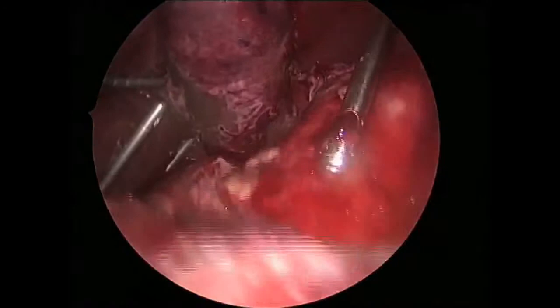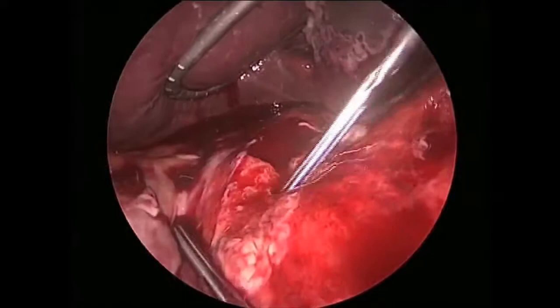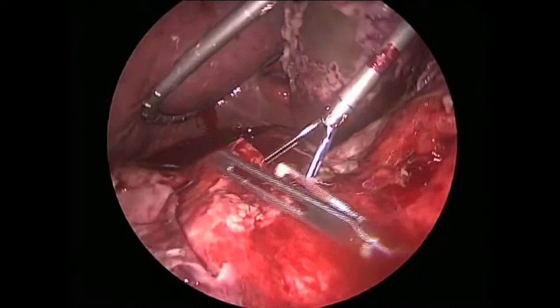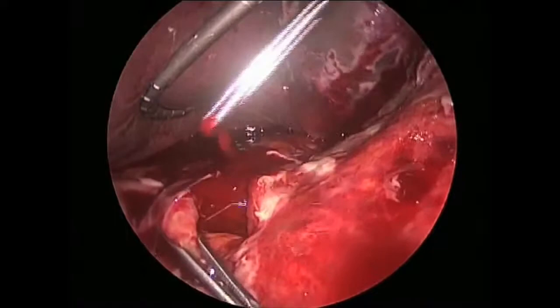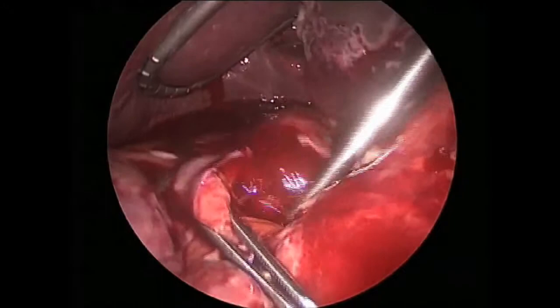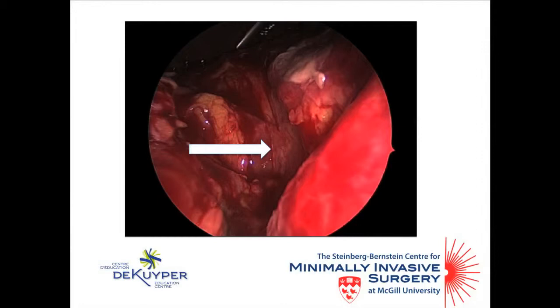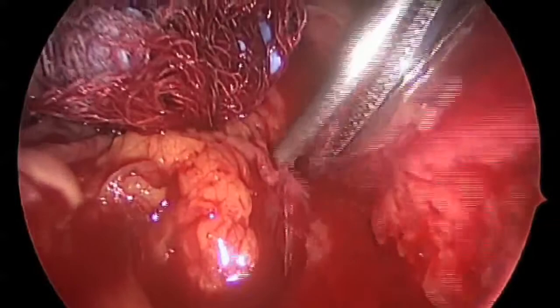We carefully and bluntly dissected the inflammatory tissue planes to identify the lateral border of the duodenum, taking care not to injure it. A linear metallic structure was seen. We were able to identify and remove the foreign body, which appeared to be a bristle from a barbecue brush. There was no evidence of injury to the duodenum.